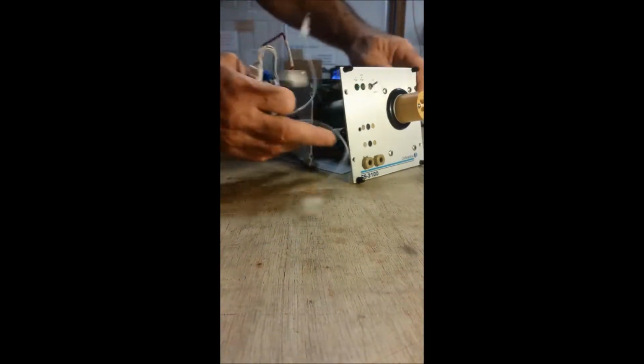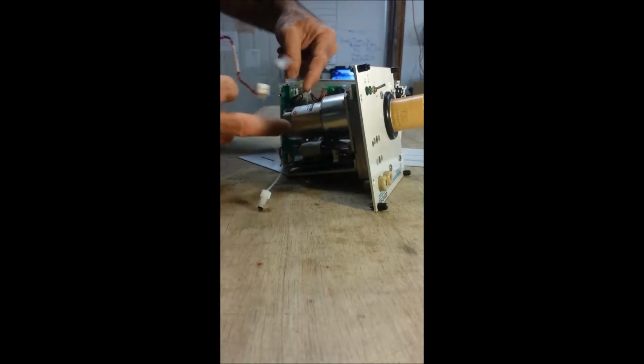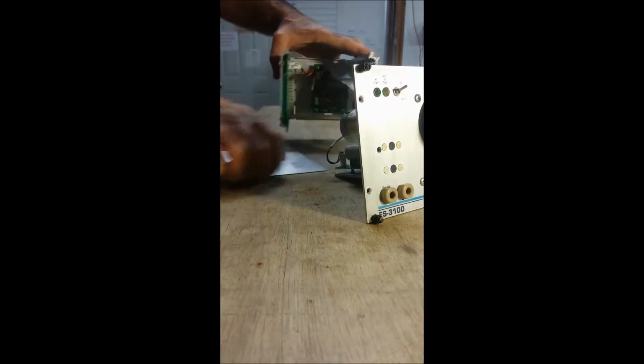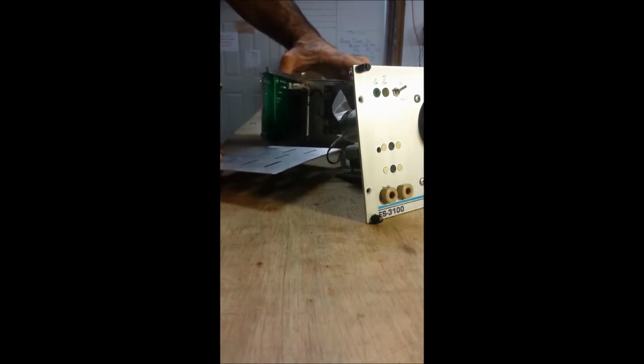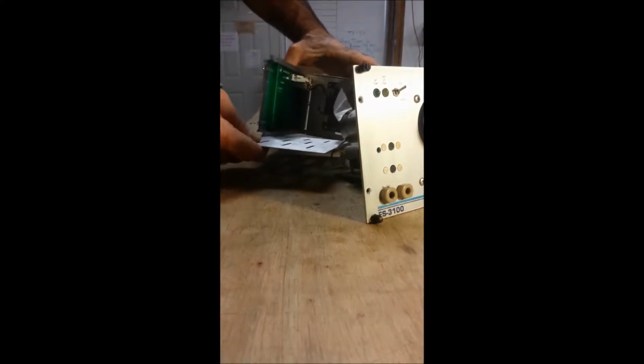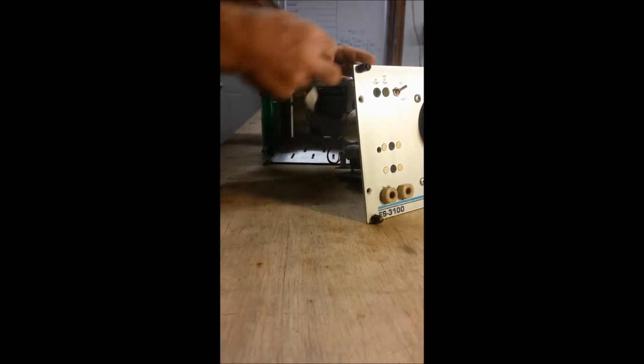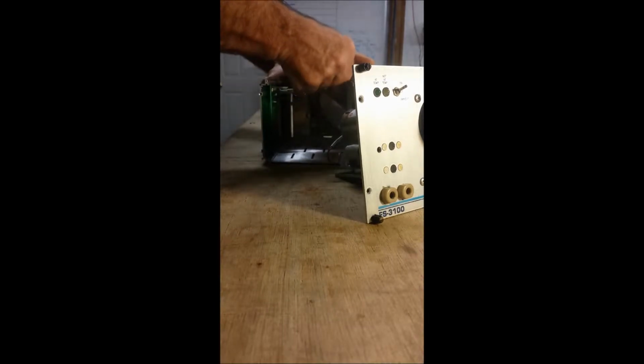You've got two. One of them goes to the front panel, which is for the light and sensor. The other one goes back to the heater, the actual power supply. When you put these together, you've got a plate here, and that's going to slide in the bottom, and it's a little annoying. You've got to kind of hold it in place. And then the valve module itself comes into the back here. Some people just take it out during this process as well.